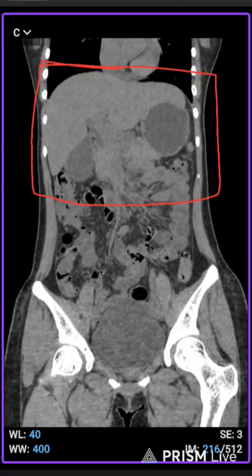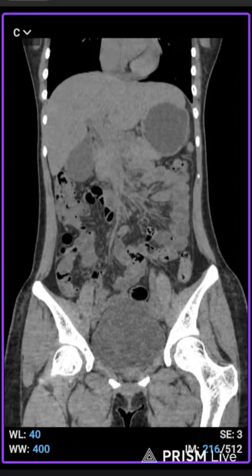After that, you will prepare for the contrast study. If you have an injector, it's good, but if you push the contrast manually, the result is not that good, because the technician who injects the contrast takes time to get outside the CT room. So you have a little bit of tricks about safety.